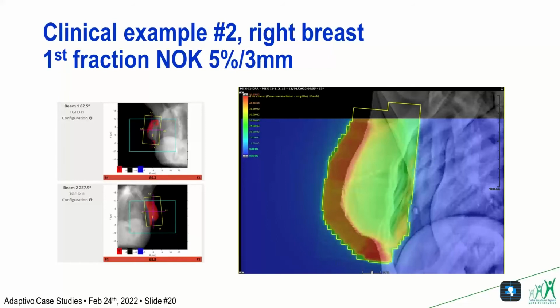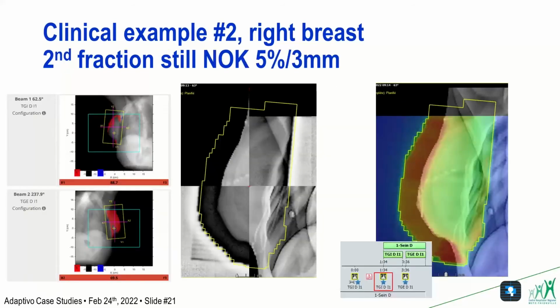So we were wondering why, since it was okay. So we programmed a second acquisition at the second fraction, but still we had the same with our EPID image that is correct in the middle. But like 1 minute later, the patient had moved and the integrated images were not correct.